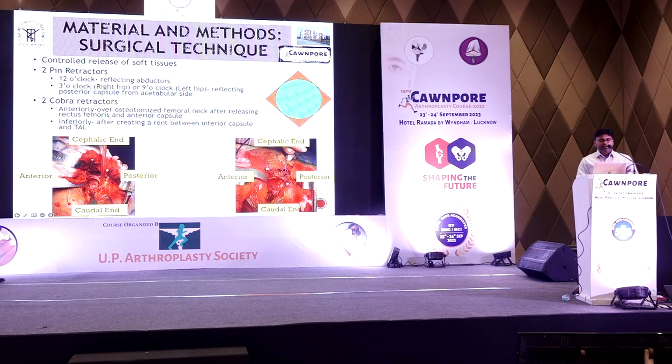Just to brief what exactly I do in my technique: I put two pin retractors, one superiorly and one on the posterior aspect, and two cobra retractors, one anteriorly and one inferiorly. This is an orthogonal placement, so it's easy to remember, and I can guarantee you that it's easily reproducible because I have done it in many cases.